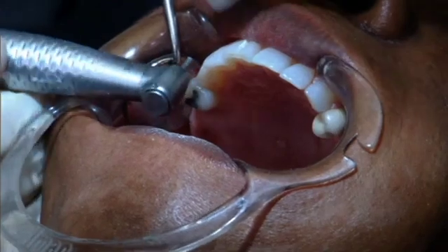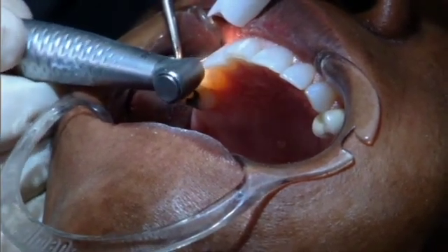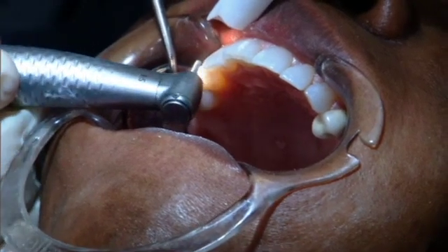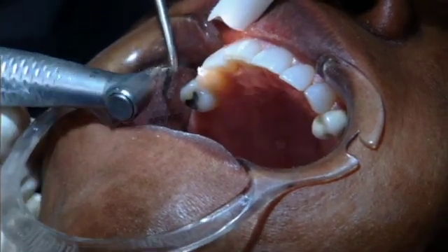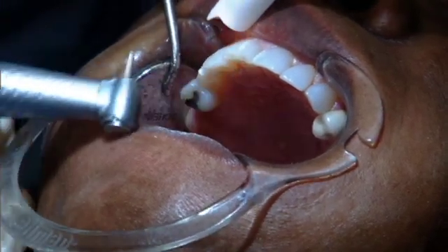We'll do the same thing on the canine. I'll make a depth cut in the gingival 1/3, then I'll come out onto the incisal 1/3 and do the same thing. I'll connect those, and now I have two-plane reduction.